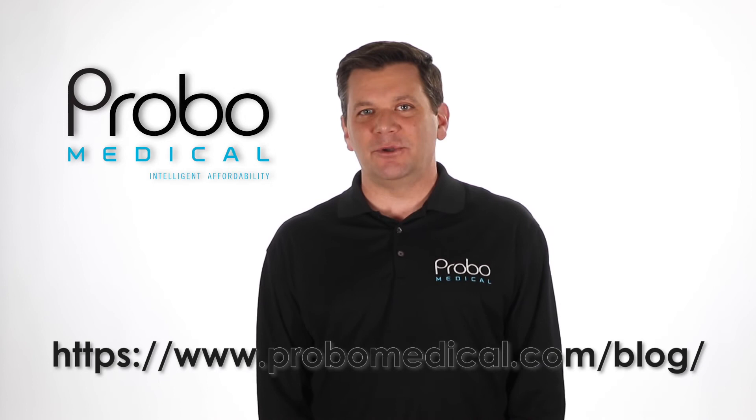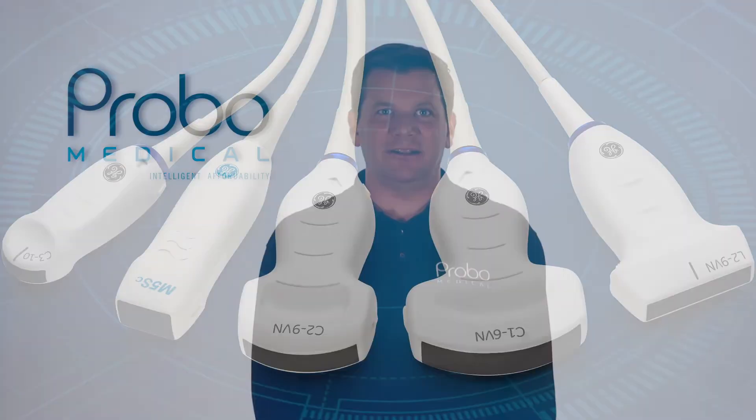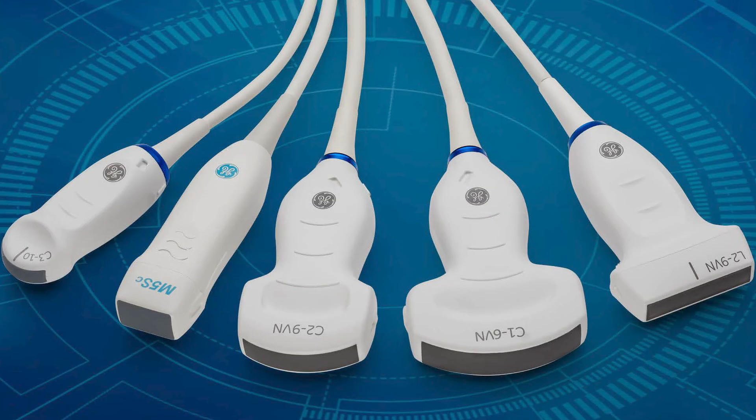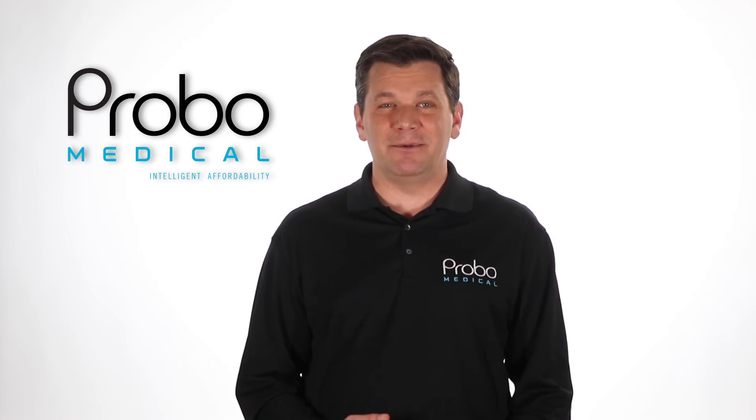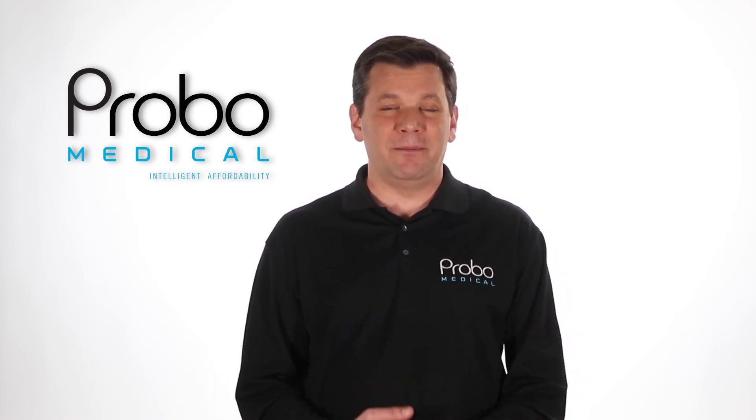Next on the technology is single crystal probes. GE calls this XD Clear. This is a big deal on any system. They have less heat, better transmission, wider bandwidth, better sensitivity — and this equals better penetration, better image quality, and a more uniform image. And this is true. It's fantastic.